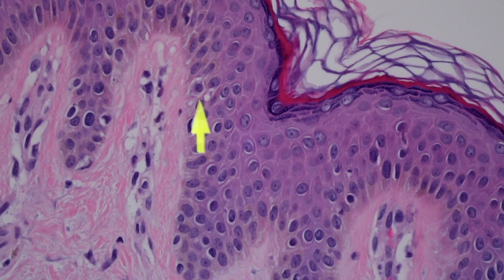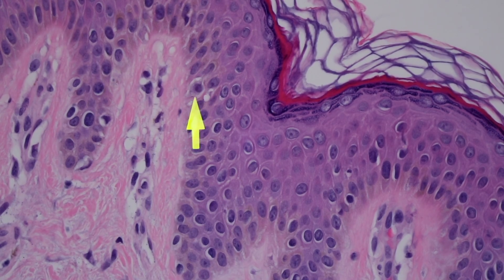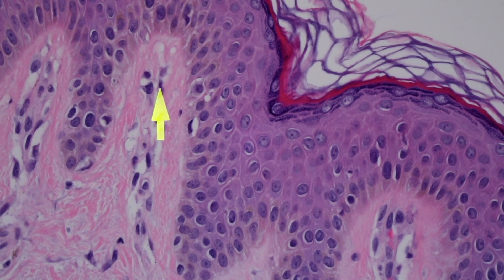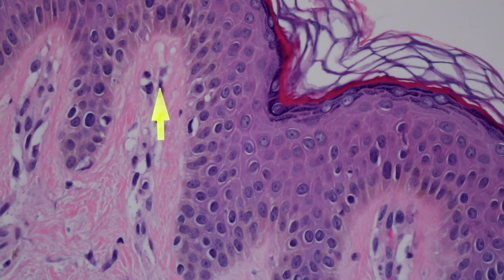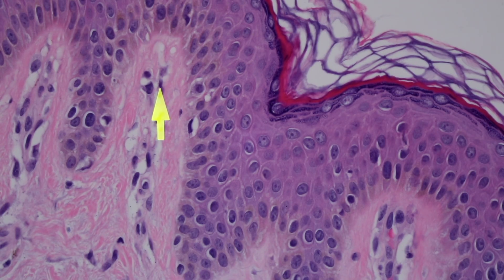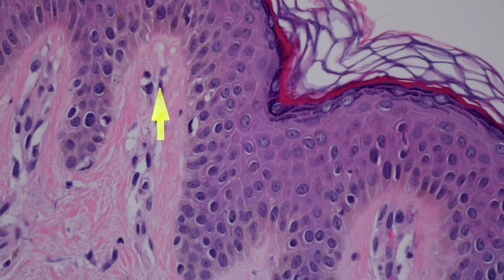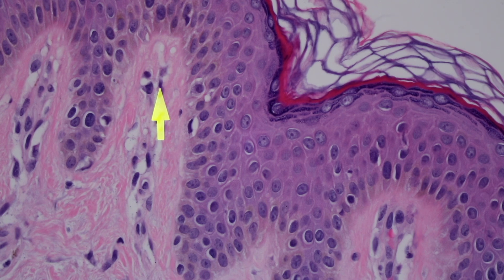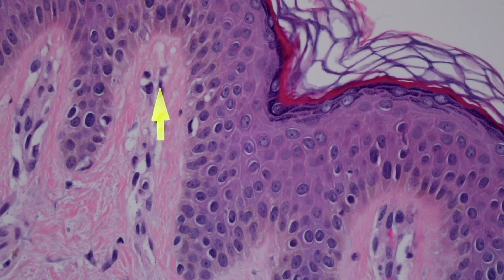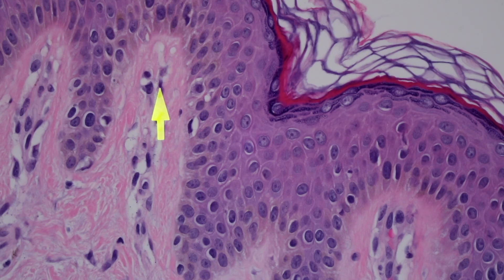Back to this little gray cell - it has a vacuole around the outside, and that's an artifact. The reason it has that vacuole is because the cell shrinks during processing and its cytoplasm clumps up to the nucleus. The vacuole forms around the outside because it doesn't have any desmosomes to hang on to its neighbors, so that's a melanocyte.